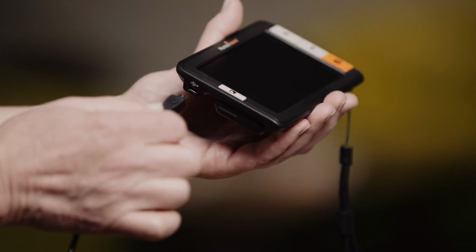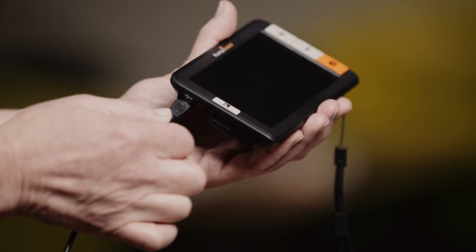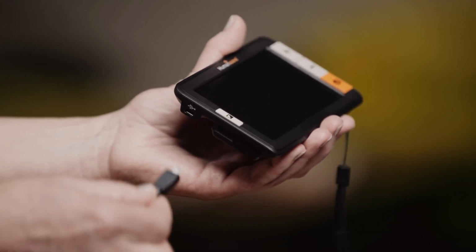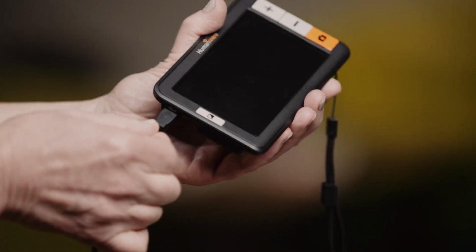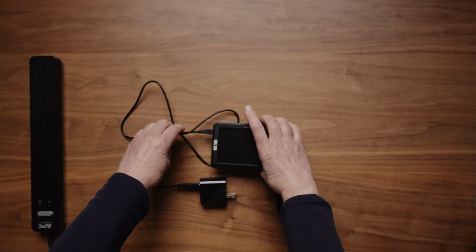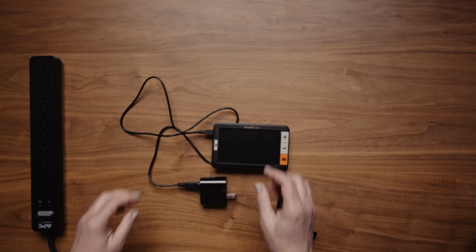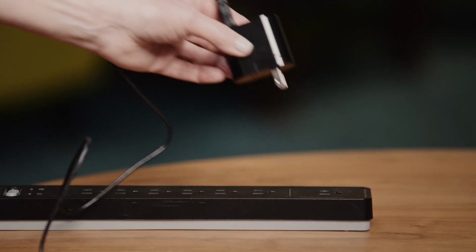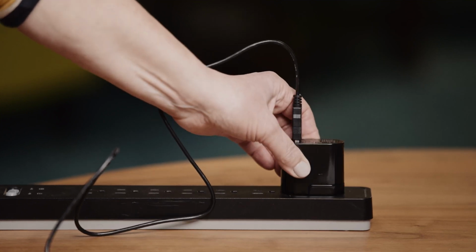Note: if the cable is not going in easily, don't force it. Just flip it over and try to fit it in the port one more time. The cable should go in with very little effort. 4. Plug the power adapter into an electrical outlet.